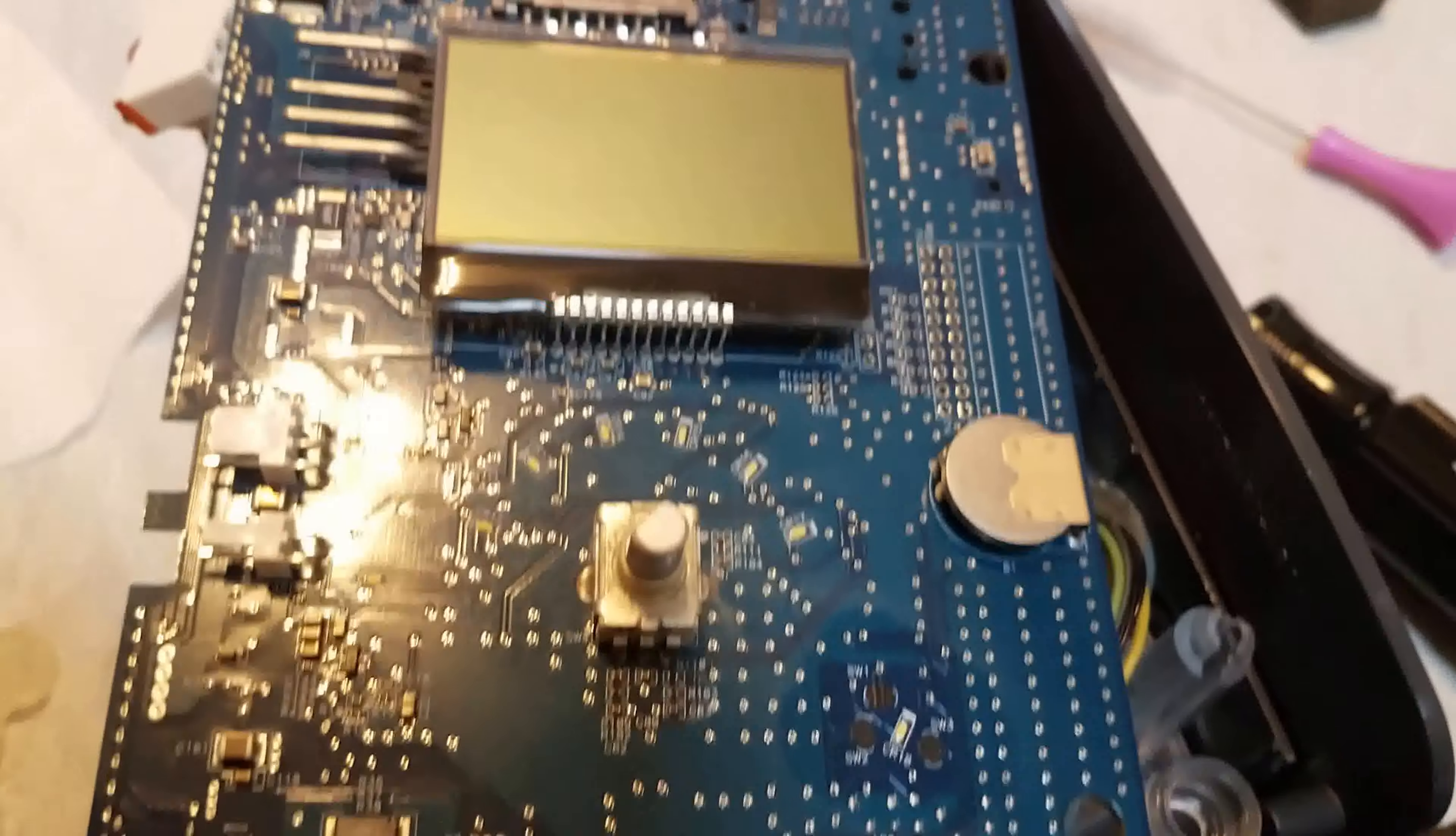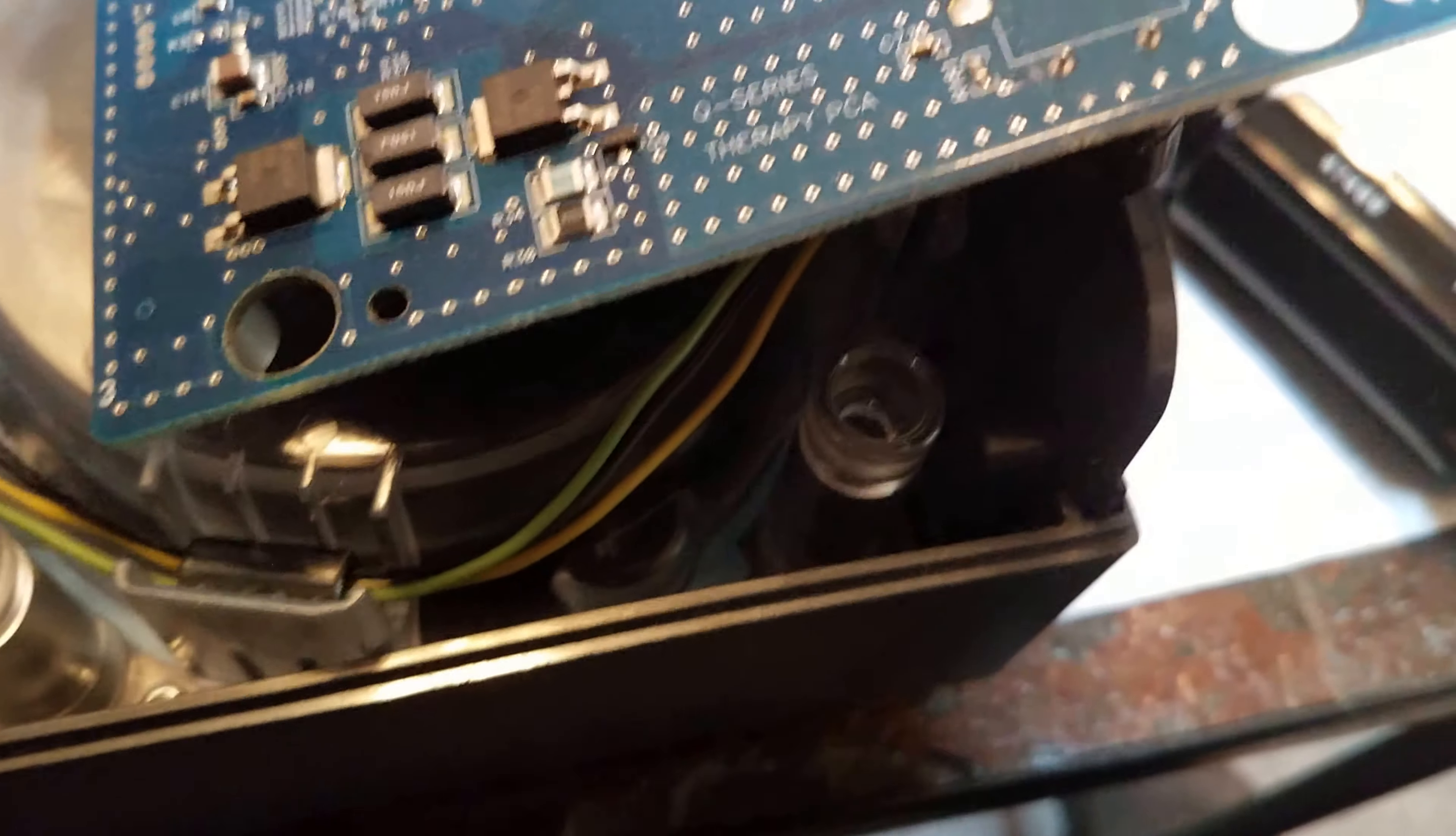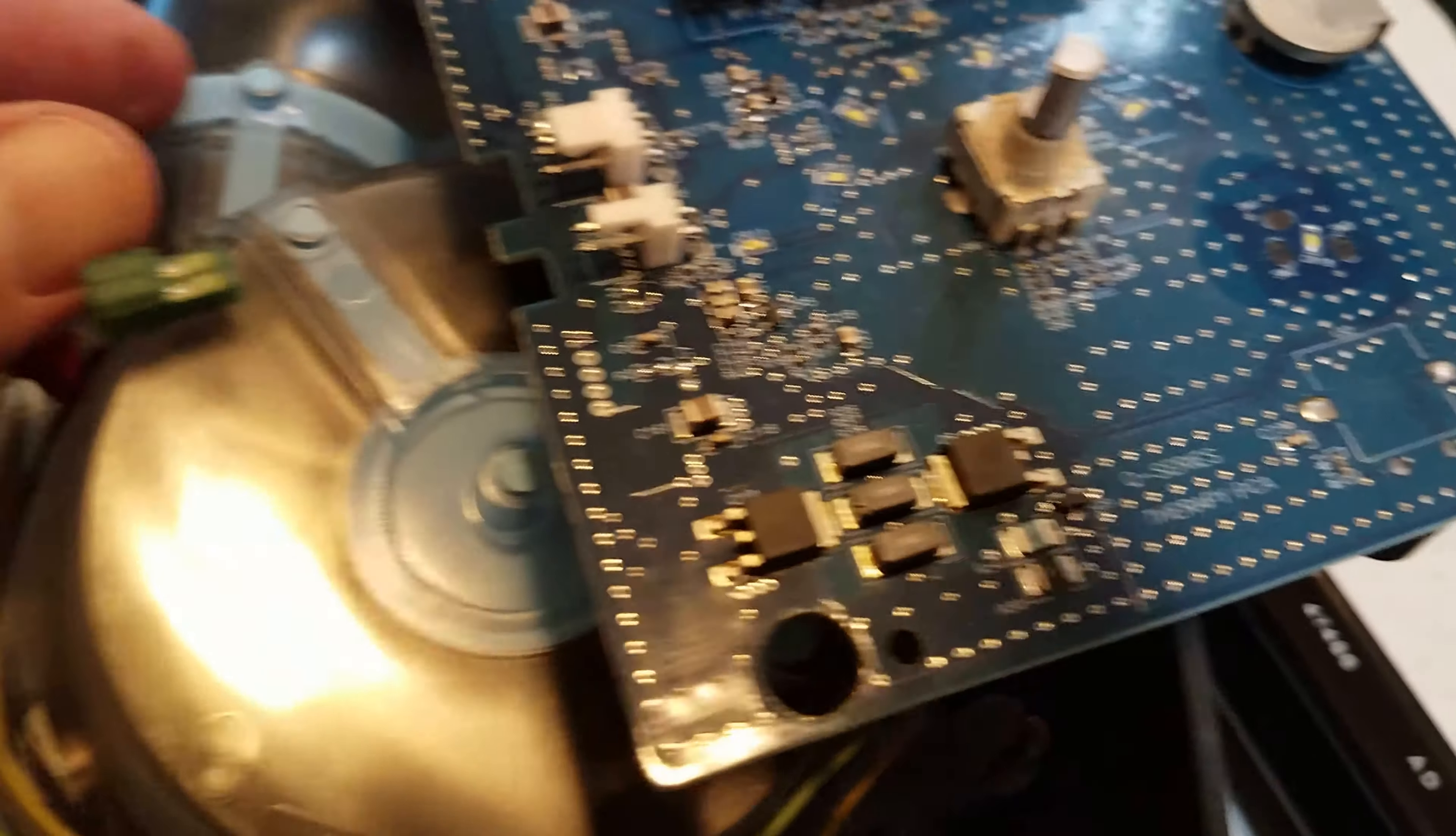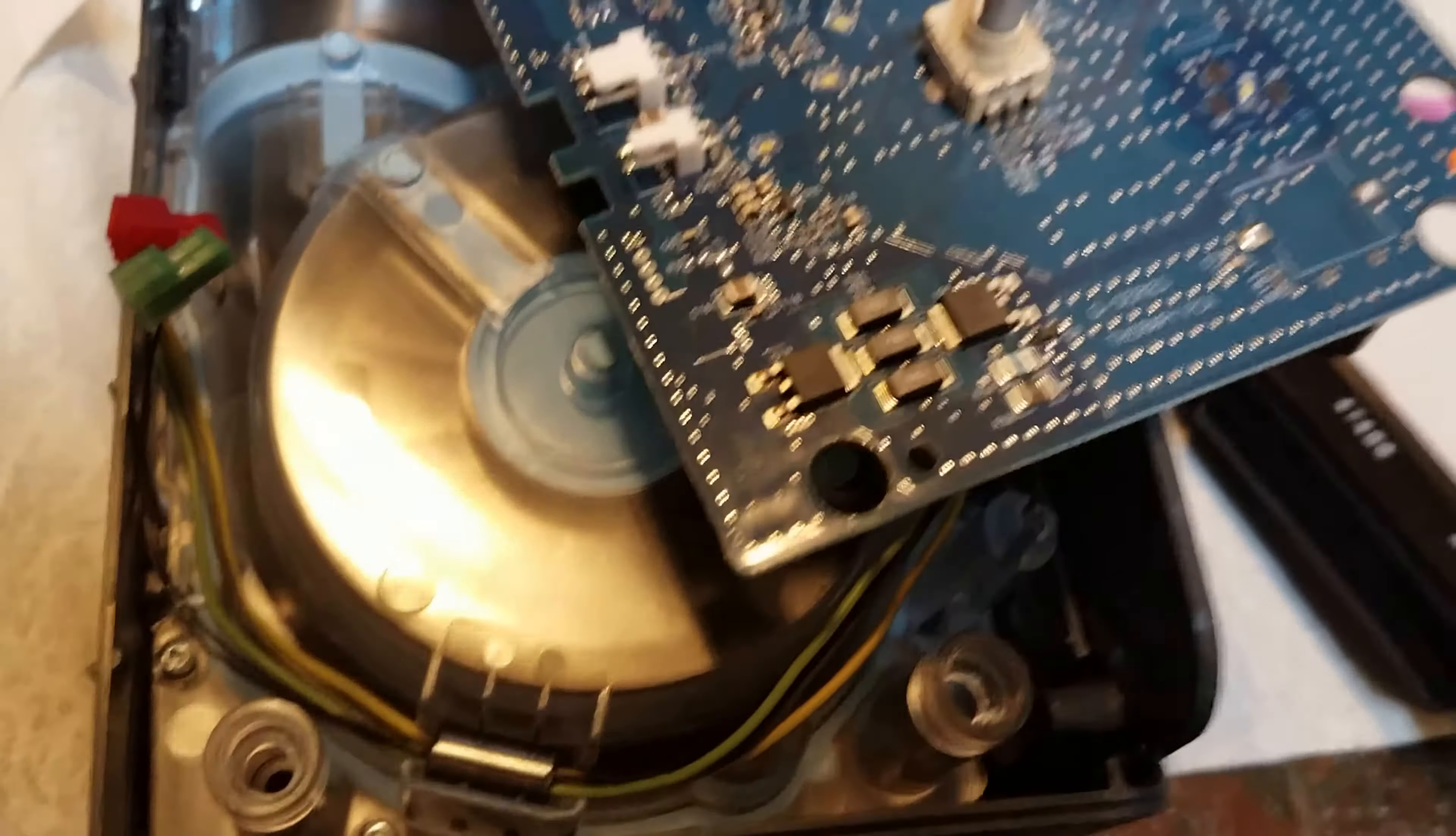There is the connector for this. It only fits on one way, and then these two connectors they fit on just the way that you think they should. Make sure you don't reverse them, but just in case don't be an idiot and put them on backwards. This one you put on with the wires facing down, and this one you put on with the wires coming down back into it.